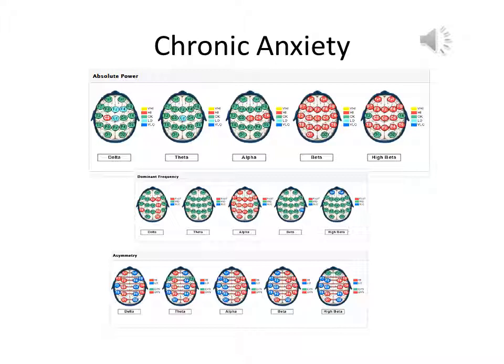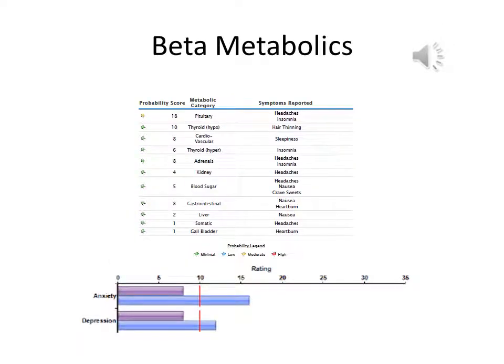We also see a very strong, very marked beta asymmetry, and you can see in the asymmetry in the third tier below a lot of red in the right hemisphere in the beta frequencies. Here we have the metabolic report on the same individual. We can see that the thyroid and pituitary endocrine systems are starting to show problems. The pituitary issue is getting significant, with insomnia and constant headaches. We have elevated anxiety measures in the ISI. Below that, we can see the anxiety is getting above 15, and depressive features are starting to emerge as well.